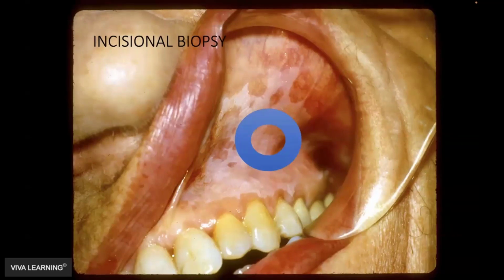and I have to orient the biopsy, because the area superior to it may be benign, the area posterior to it may be benign, the area anterior to it may be benign, but the area inferior to it may be malignant. Don't know. That's for the pathologist to tell us. So we need to be able to orient the incisional biopsy. So how do we do that?